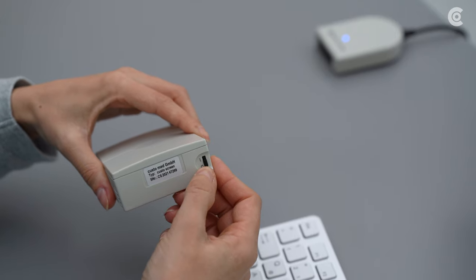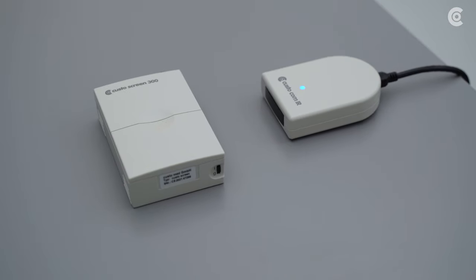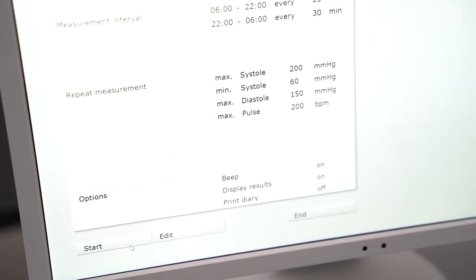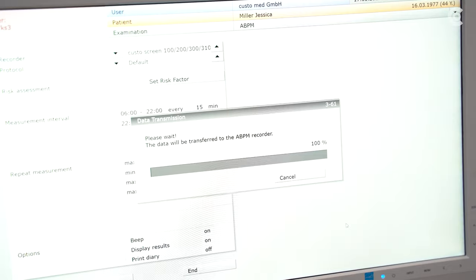Turn on the Screen 300 and place it in front of the infrared interface. Then start the device. Wait until the data transfer has been completed and confirm the transfer.